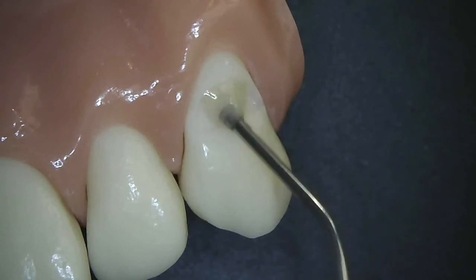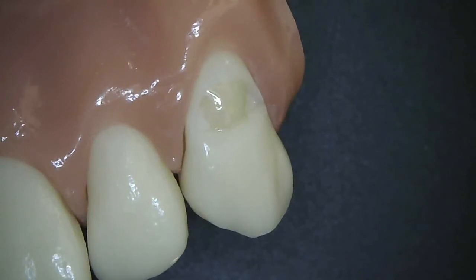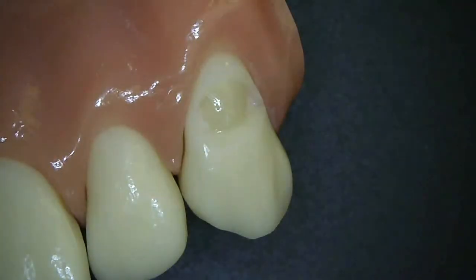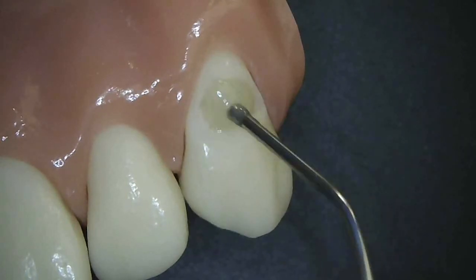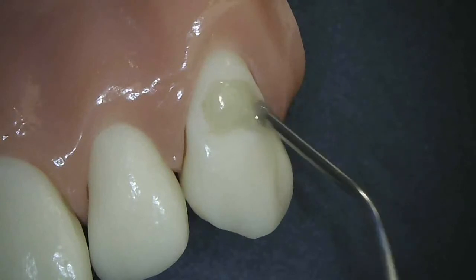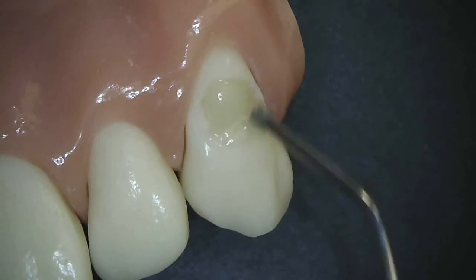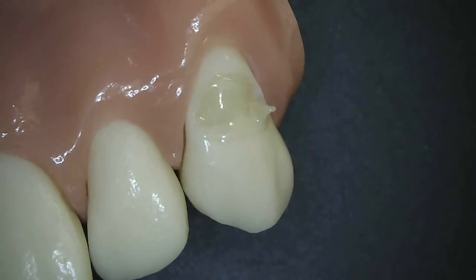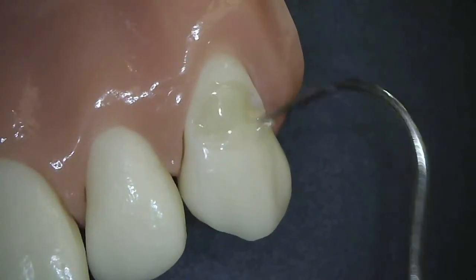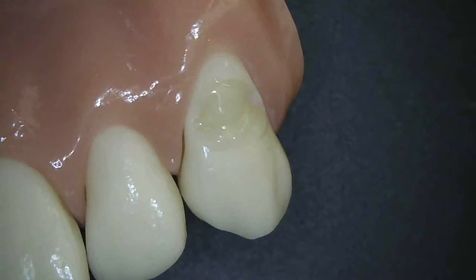I'll do this in two or three increments. This first increment fills in most of the preparation and can be cured for 20 seconds. Then I place my next layer, and you can bring the material down using the syringe tip to the facial surface of the tooth to gain more strength on an enamel bond, or use an explorer tip or a perioprobe to bring the material down — either way.